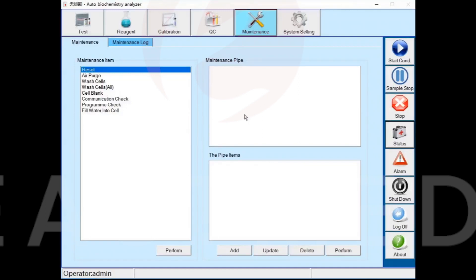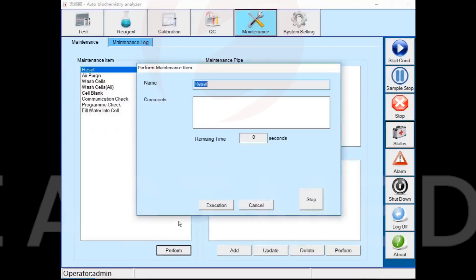The reset function causes all parts of the instrument to perform a reset action to detect if every part is working properly. When an operation is not proper, the machine will alarm. Reset function should be performed every day when starting the machine.